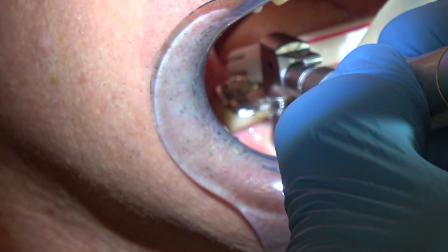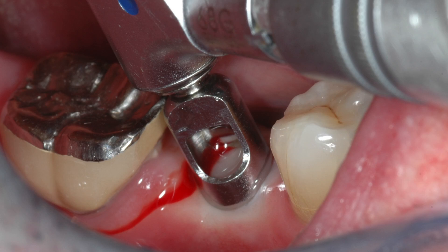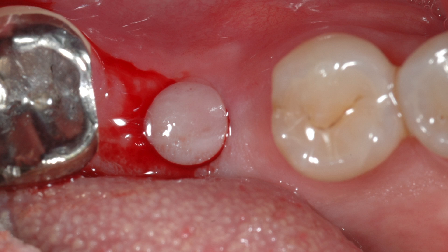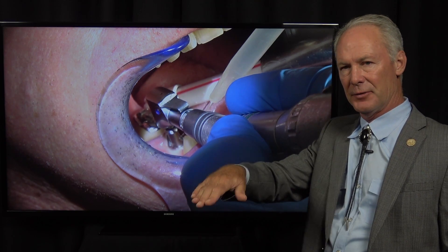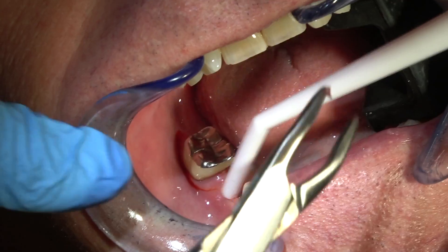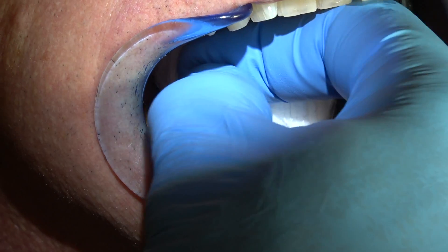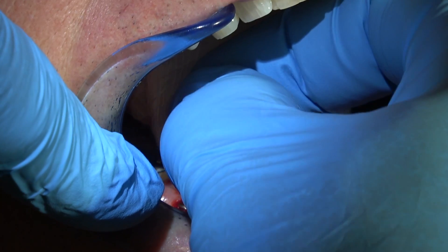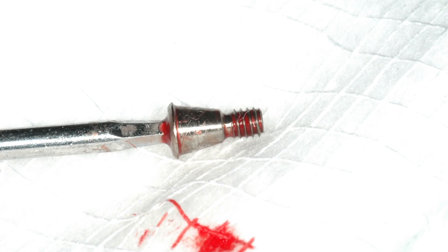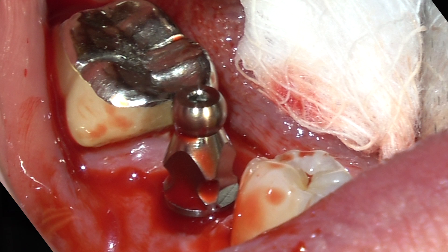I'm giving local anesthesia, and I'm using this punch to just punch a hole in the gingival tissue. So this is after the tooth's been extracted, platelet-rich fibrin, resorbable collagen membrane, healed for six months. Implant then placed after six months, allowed to osseointegrate for three months, and now we're back to take the impression. There's the implant — I'm unscrewing the healing cap. This is a flat healing cap that's been in the implant for three months. There's the implant, and now I'm screwing in an impression coping.